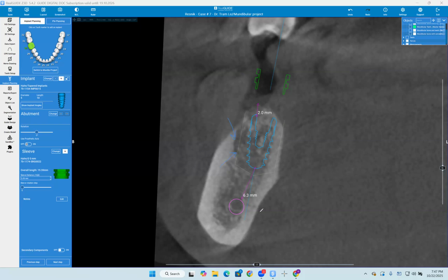No, it's a cortical canaliculus. Okay. So how long ago was the graft? Do you know? Exactly a year ago. Oh, wow. Okay. So that bone never turned over. So you're going to be placing the implant, Doc? Yeah, I want to.